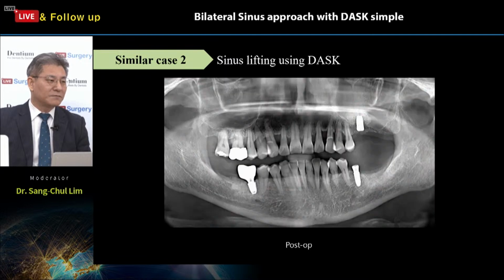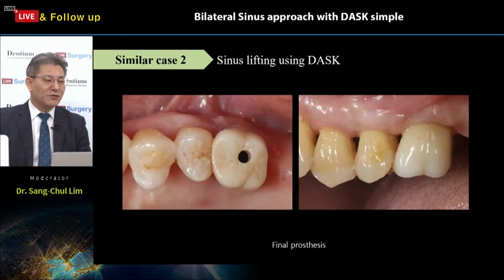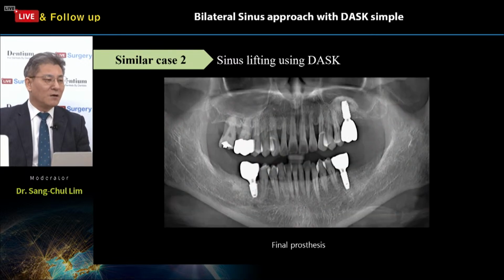Okay, so we can clearly see the grafting materials in the sinus cavities with the Bright implant system, the bone level. And this one is the temporization. And the final restoration is zirconia with a customized abutment. Okay, final restoration panoramic view.